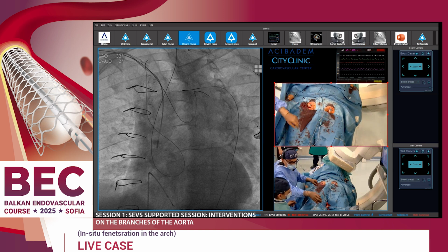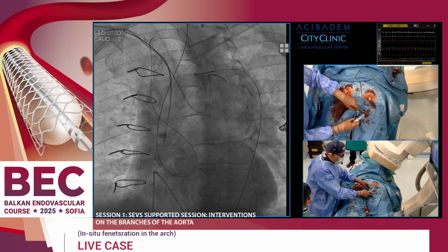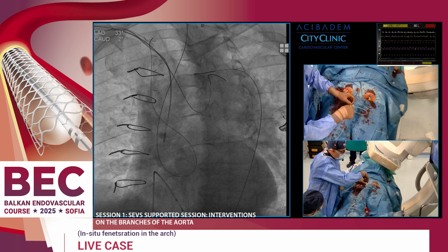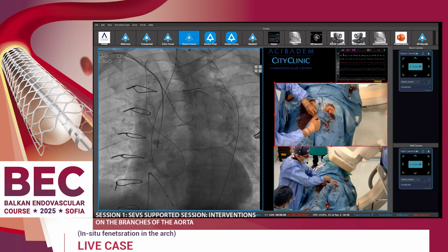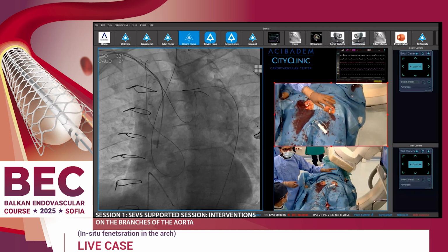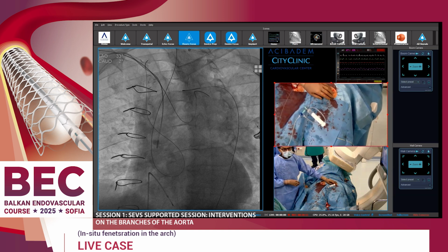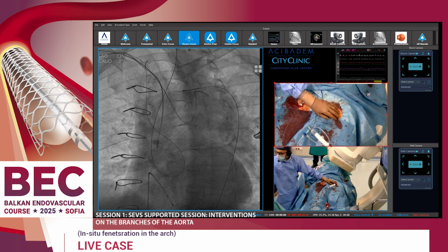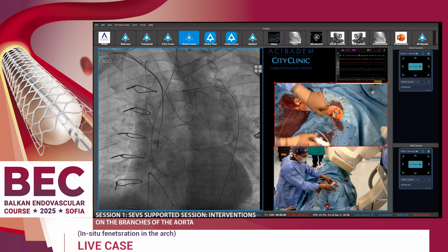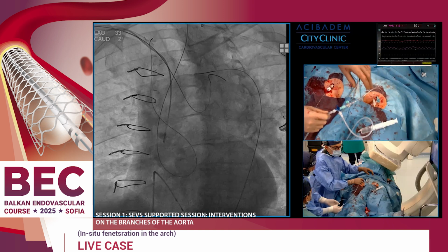Okay, we are going to flush very thoroughly everything before starting the connection. Ivo, could you zoom in on that so we can see what you have in there? Please zoom here a little more and centralize. Excellent, very good. So, I'm explaining. This is the femoral sheath.